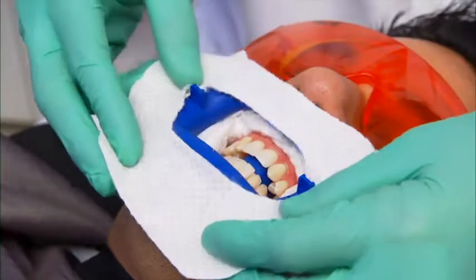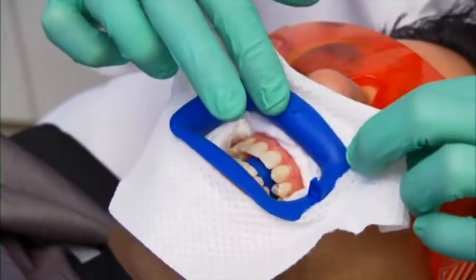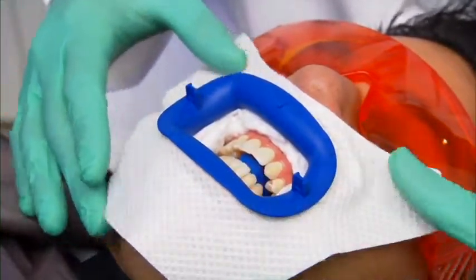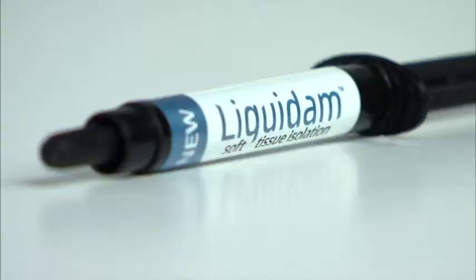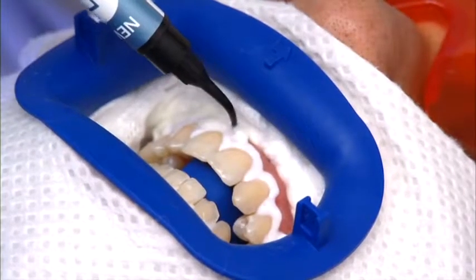Carefully place one face bib around the retractor, one side at a time. Add an additional bib for heavy salivators. Liquidam Dental Dam is used to completely protect soft tissue. It is important to ensure that no pink is showing.